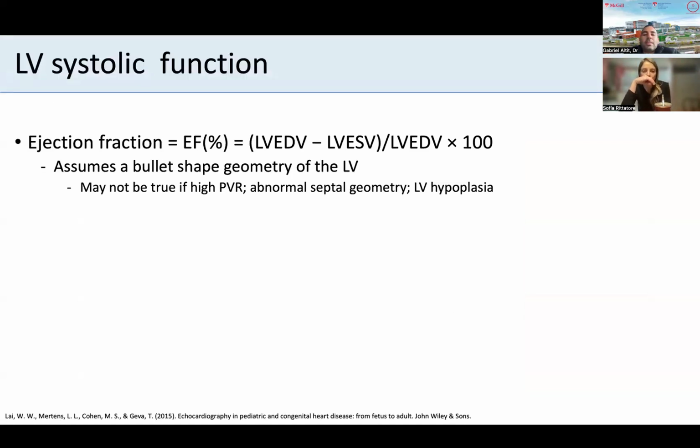Ejection fraction has been classically used as the gold standard of systolic function. Now, as I mentioned, it's very easy for a left ventricle to empty against very low afterload. If there's torrential mitral regurg, it's very easy for the LV to send everything backward. Similarly, if your aorta has very, very low vascular resistance or the afterload starts dropping, for example if you have a hemorrhage because your aorta is transected, then your LV is going to be contracting very well. But then if you increase your SVR or control your hemorrhage, then your LV may be facing very high afterload suddenly and may start failing.